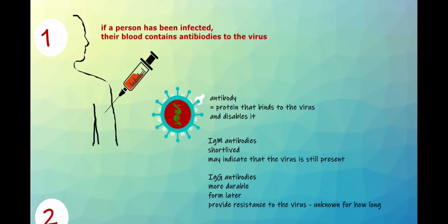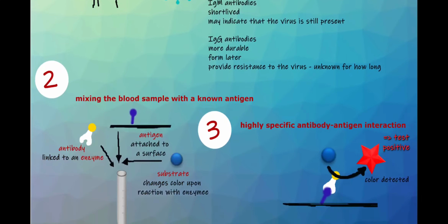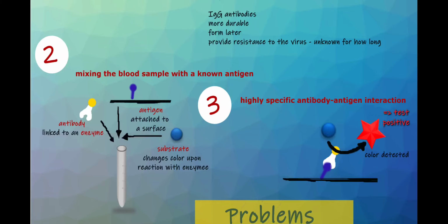Let me begin how they are detecting. Before that, we have to see what requirements have to be taken for this kind of test. For that, we need three basic things. First of all, our target antibody. Target antibody means a sample antibody which is known as the target antibody. That target antibody we can take as blood itself, raw blood. Then antigens have to be used. These antigens are actually controls to know whether the antibodies are present or not.